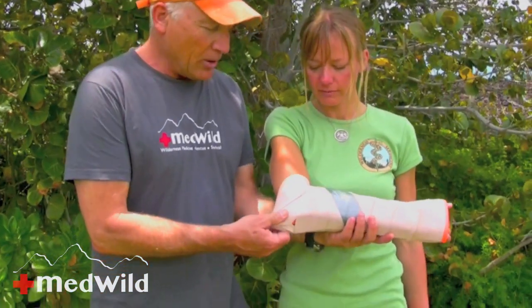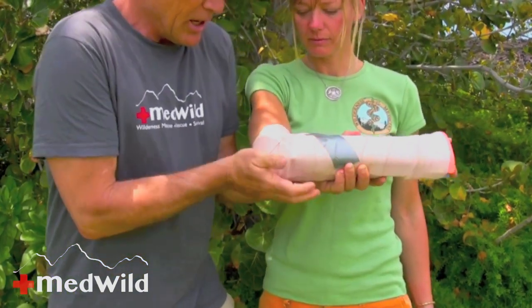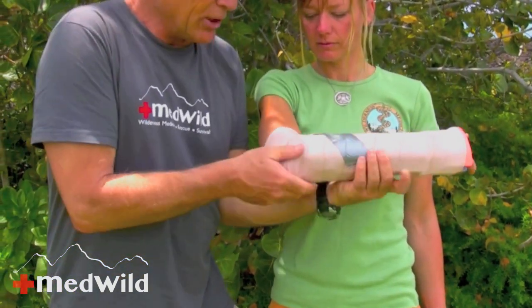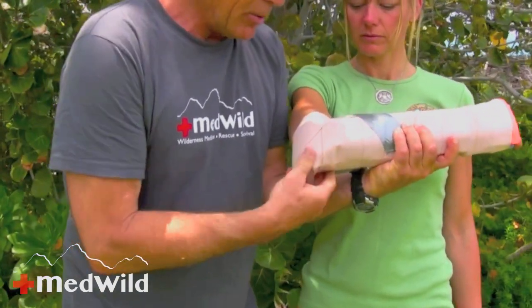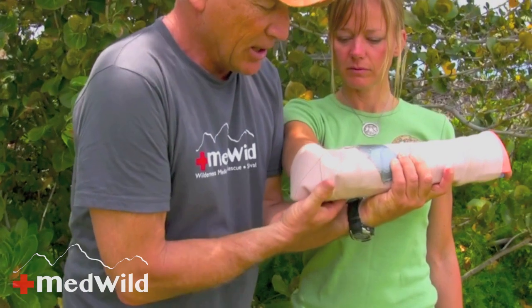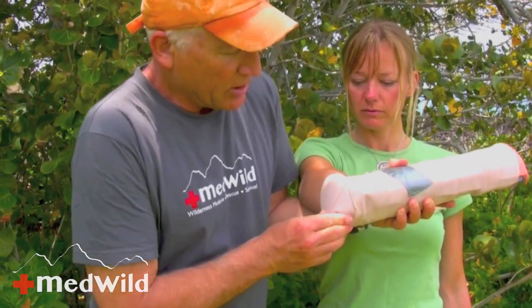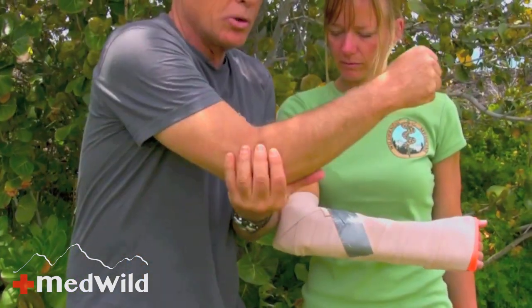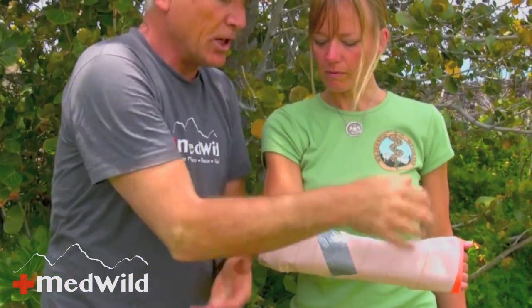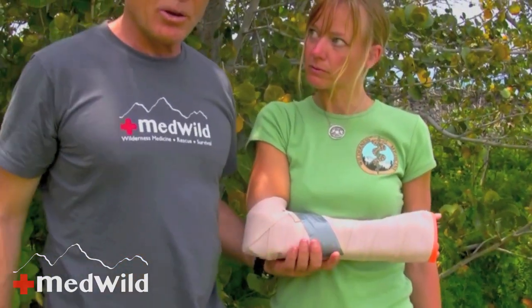At this point I'm going to take the elbow and bend this excess SAM splint material around, really trying to mold it to increase immobility around her elbow. I get the extra areas of SAM and tuck them under so it puts a little bit of compression around her elbow, which helps to limit rotation. Putting her into a sling also really helps to limit rotation.